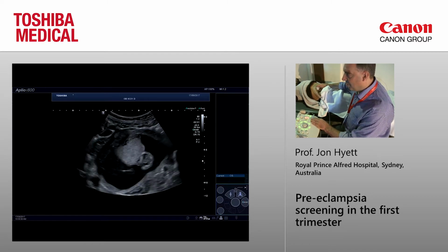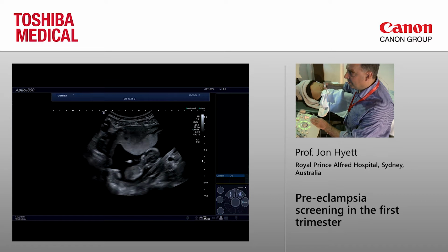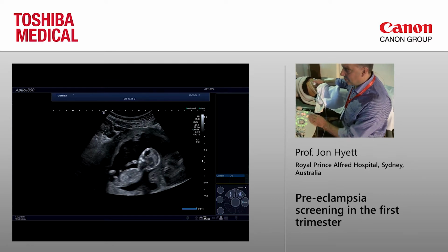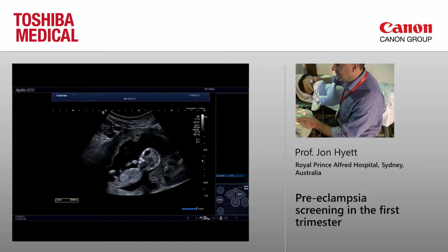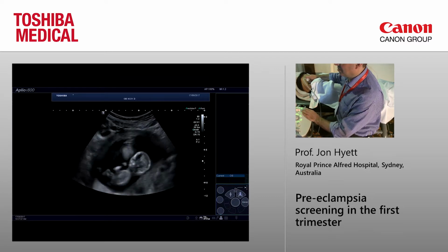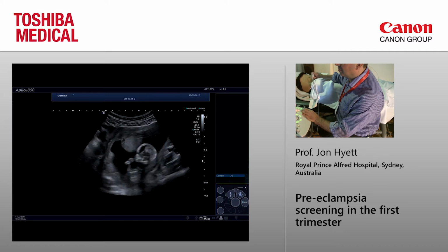So just before we go any further, let's just sort of get our eye in. So what I might just do is just demonstrate. So we've got a crown rump length that is about 82 millimeters, so the end of 13 weeks gestation.